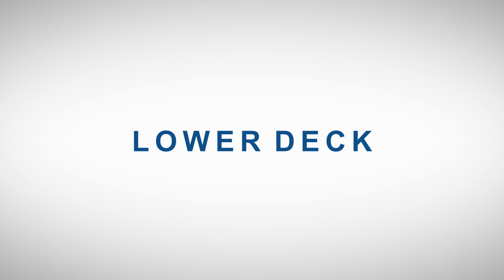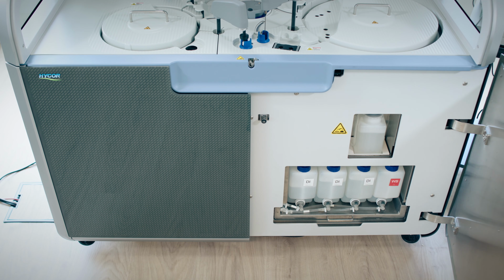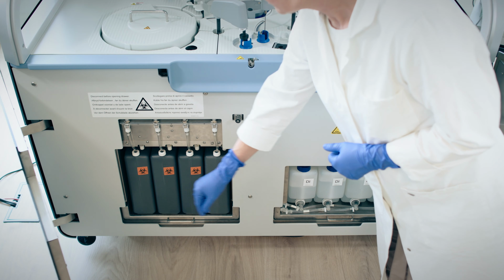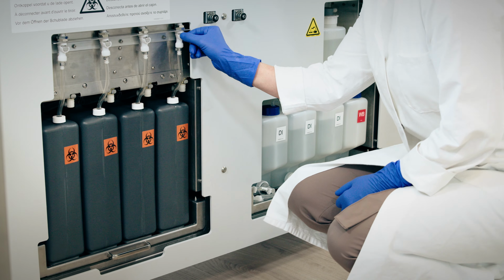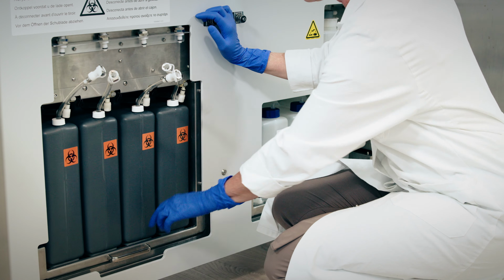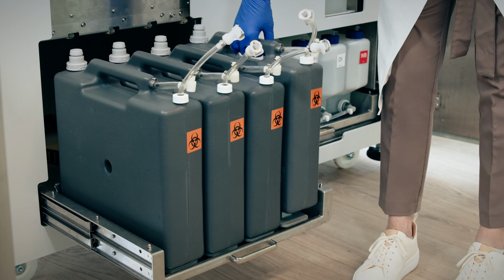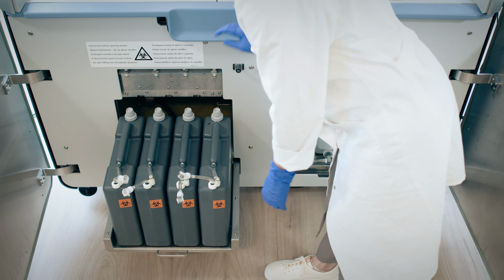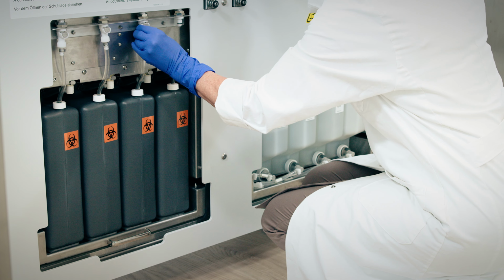Lower deck. The lower deck can be accessed through the press to open doors. On the left-hand side, we have 4 waste containers able to collect the waste of a 700 test run. After disconnecting the containers, the drawer can be pulled out for easy access to the containers. After emptying the waste containers, just put them back in the drawer. Close the drawer and reconnect the connectors.